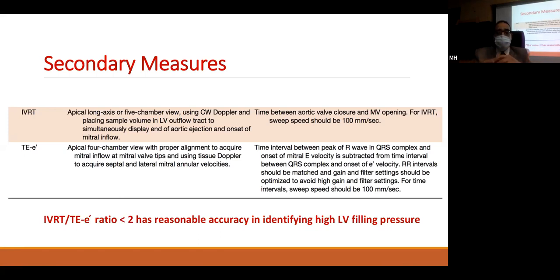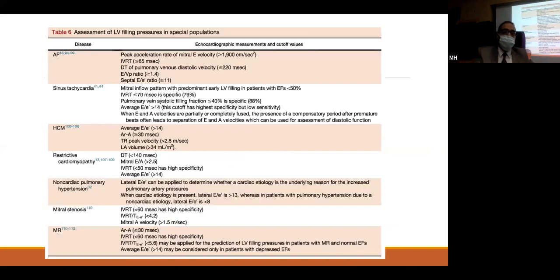All these measures, you can use them to assess the diastolic dysfunction more and more deeply, but I ask you mainly to depend, at least, on the common variables, the 4 variables that we highlighted in patients with normal ejection fraction, and also the three variables in addition to the mitral inflow velocities in patients with reduced ejection fraction.